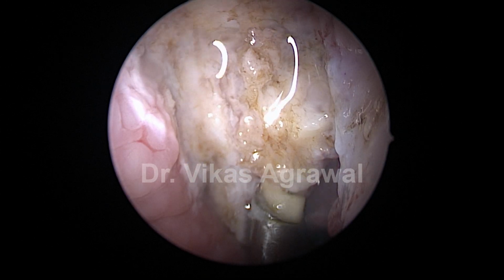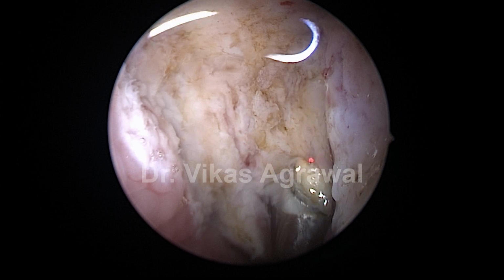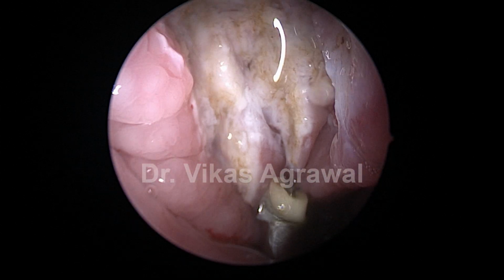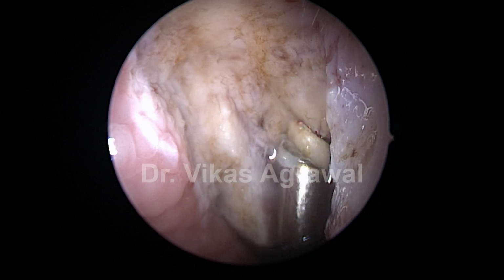So still we are only debulking the adenoids. We have not yet reached the posterior margin or the posterior boundary. We have not defined completely the lateral margin. We are still debulking because there is a huge amount of adenoid tissue present.